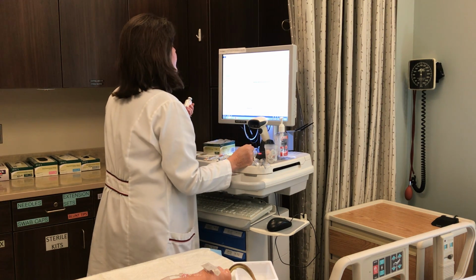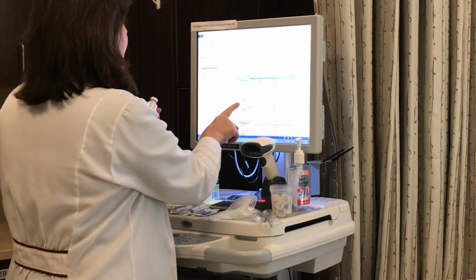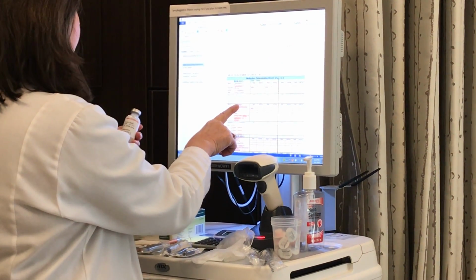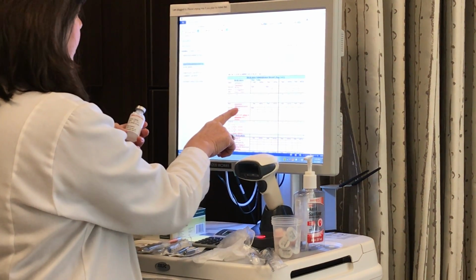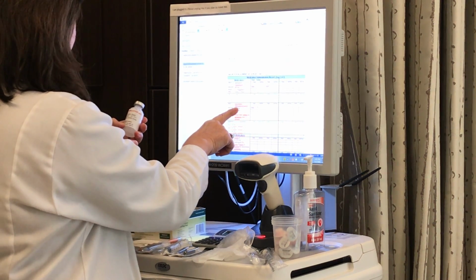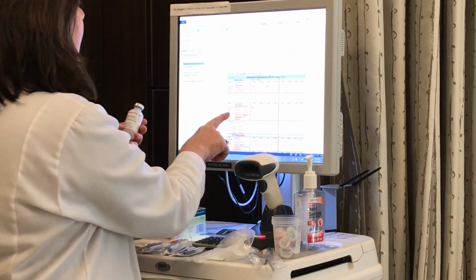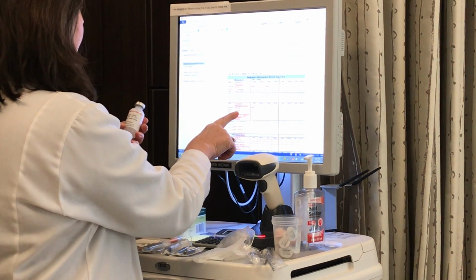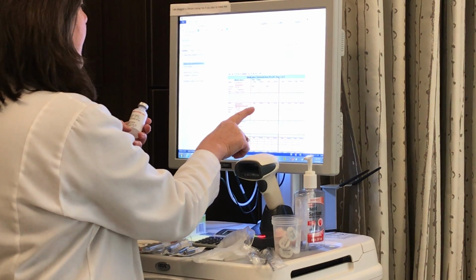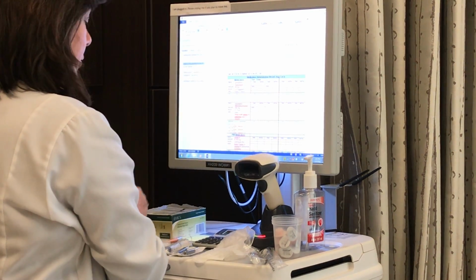First check of the 5 rights. I have Diane Curtin. Medication ordered is Solumedrol, and in my hand I have Solumedrol. The amount is 200 milligrams. In my vial, I have 125 milligrams per ml. I'll need to be doing a calculation. The route is IV push. I'll administer this IV push. Frequency is daily, and the time due is 0900, and it is currently 0900.